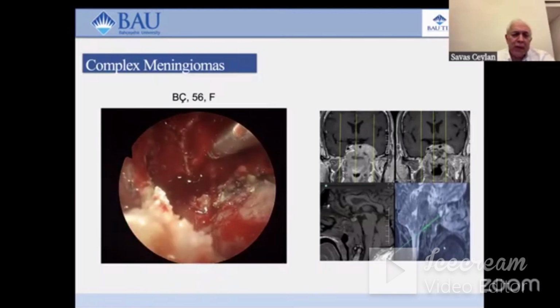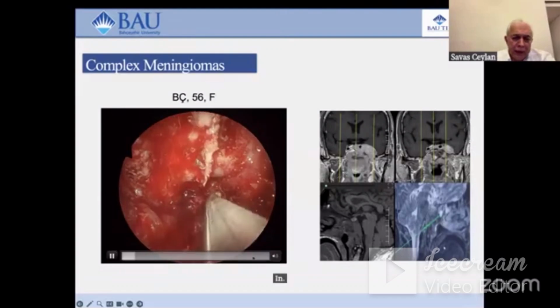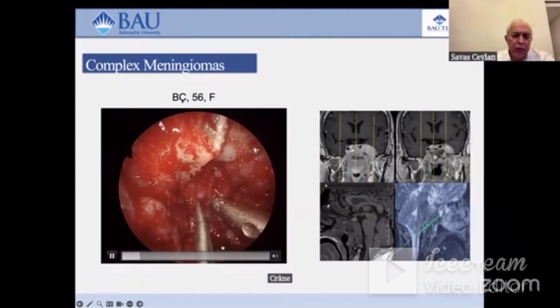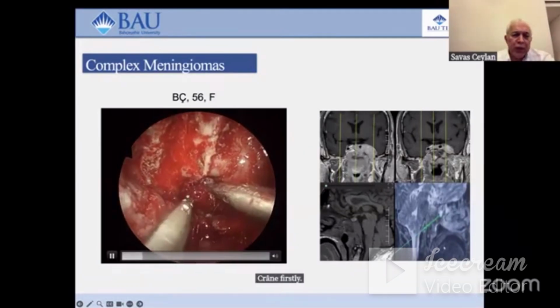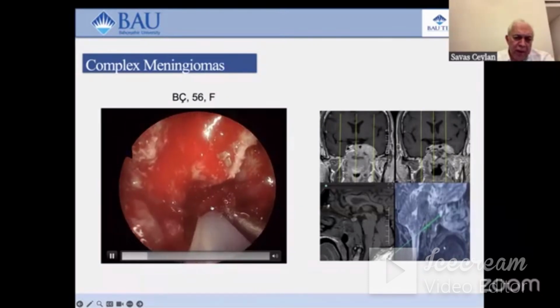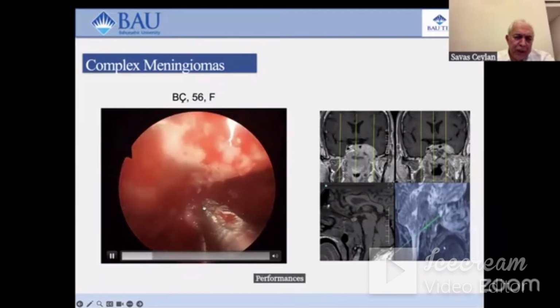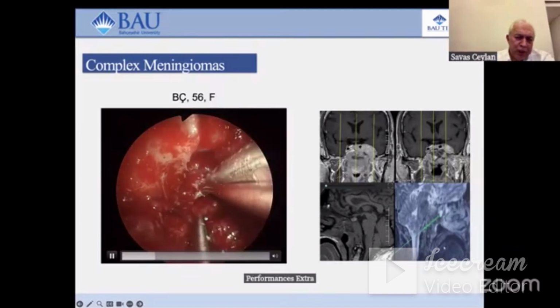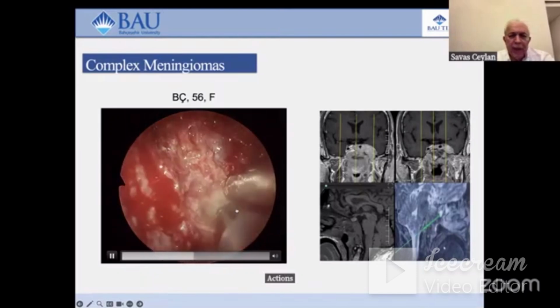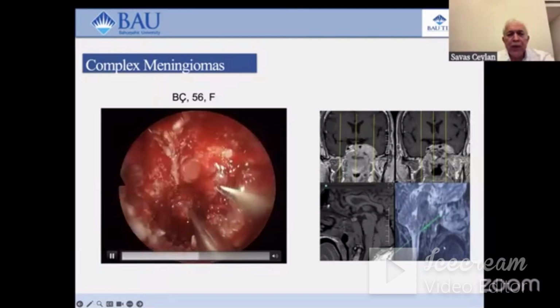The other complex tumor, this case is one of the last cases. The tumor extends to the sphenoid sinus, cavernous sinus, and craniocervical junction and odontoid tip inferiorly. Firstly, the tumor involving the sphenoid sinus was resected. At this stage, we performed extradural dissection and resection, and this tumor was resected. And then, in the second stage, we opened the cavernous sinus.